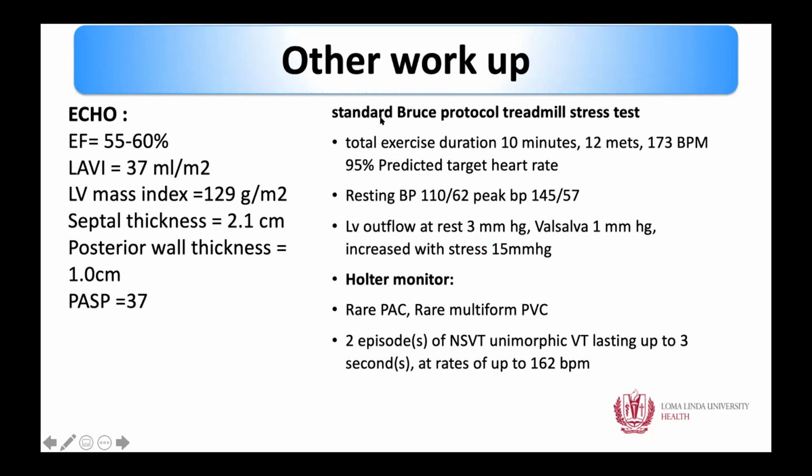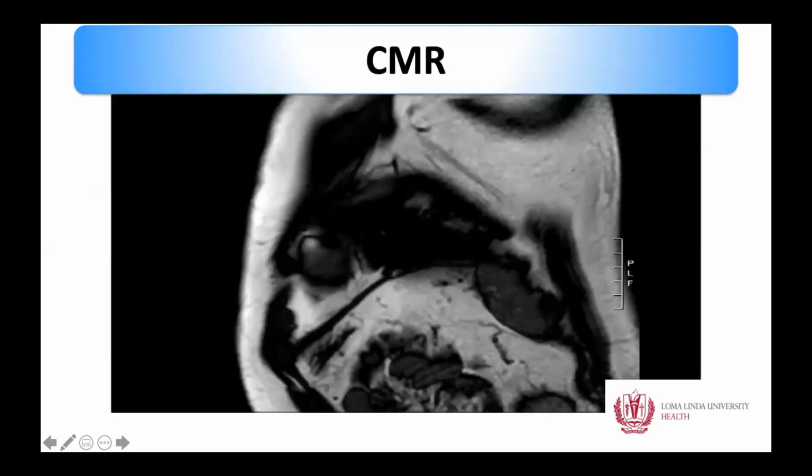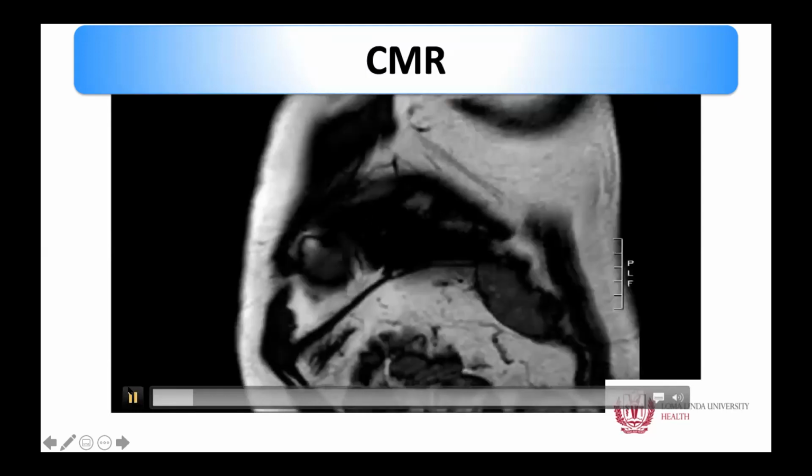And then he was also given a treadmill stress test, and he did okay on treadmill. On Holter, he had 2 episodes of non-sustained VT, lasting for 3 seconds, at the rate of 162 beats per minute. His septal thickness was 2.1, the LV mass was increased, his PASP was 37. Basically this patient has HCM. We have established that it is non-obstructive HCM, and he has VT, so he was given cardiac MRI.